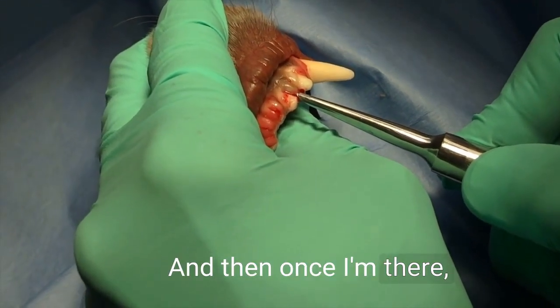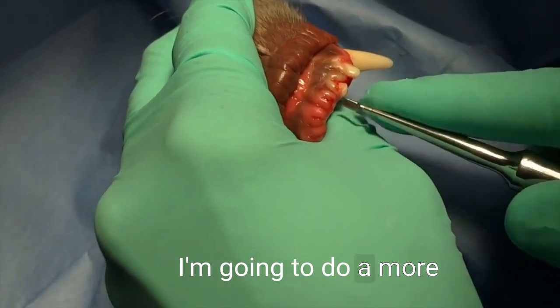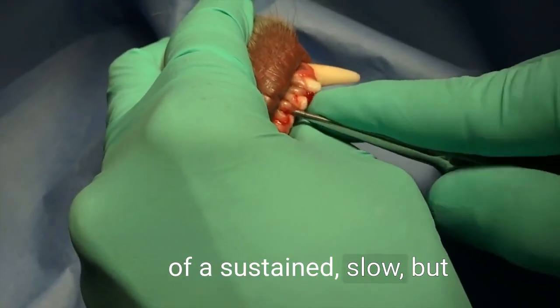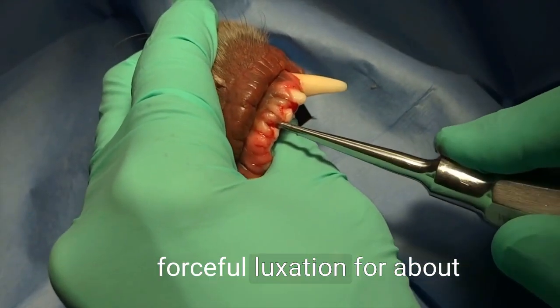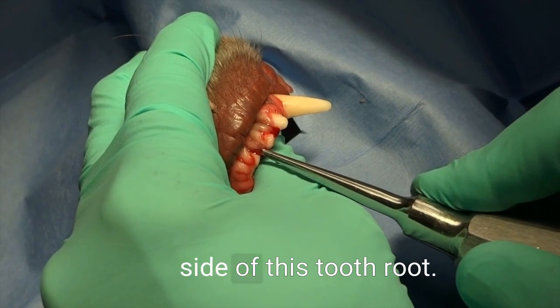Once I'm there, I'm going to stop that quick movement and do more of a sustained, slow but forceful luxation for about 15 seconds on each side of the tooth root.